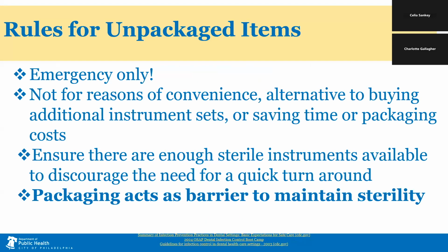Furthermore, it is important to note that sterilizing unwrapped instruments is only acceptable if they will be used immediately. This flash sterilization process should not be used to save time or money. Also, storing instruments unwrapped compromises sterility.